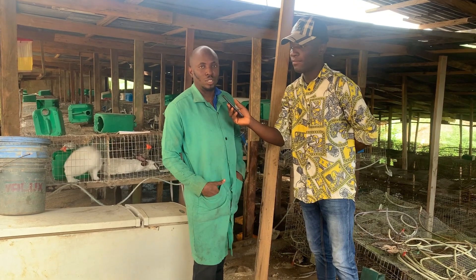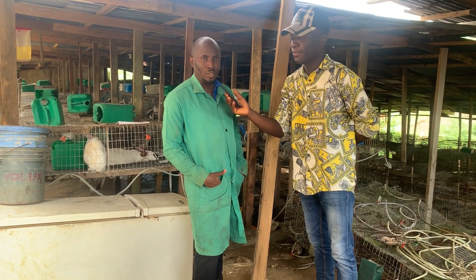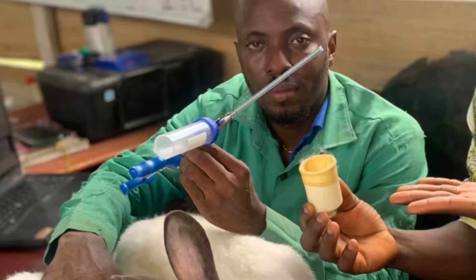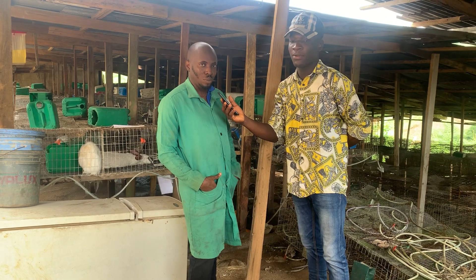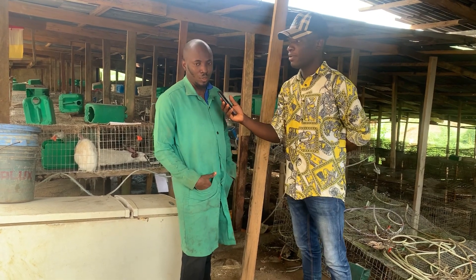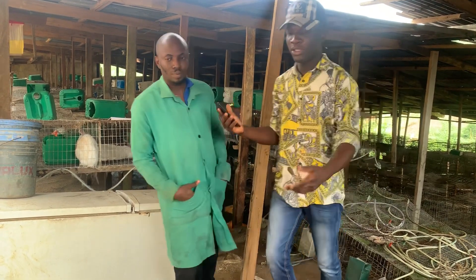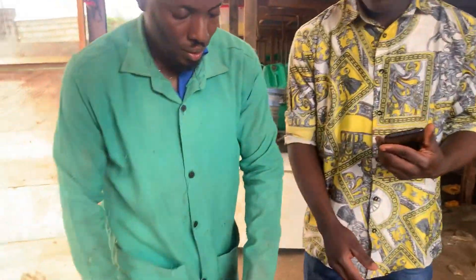Today I'll be taking you through the steps of artificial insemination. First, you need the AI gun. Then you need to train your male — of course you need a female to train your male. Today I'm going to show you how we do it all. Just show us how you use the gun.